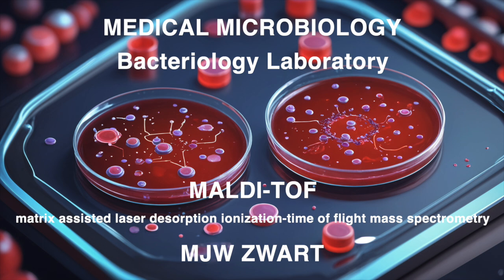Right. So the document says you apply the BTS to the target plate and analyze it, like giving the Microflex a known sample, making sure it can identify those E. coli proteins accurately. Exactly. It's got to pass the test. And it mentions marking the vial every time you thaw the BTS. Why is that so important? That's a good catch. The BTS has a limited number of freeze-thaw cycles before its performance might start to go downhill. Marking the vial helps you keep track of those cycles and make sure you're using a fresh BTS. Makes sense. Got to keep it fresh.